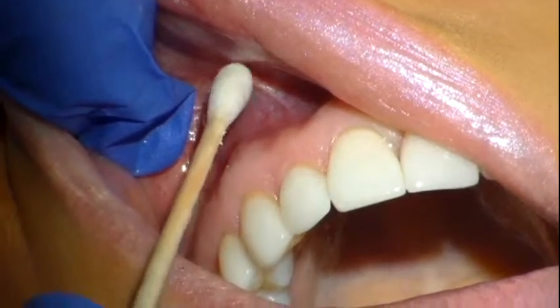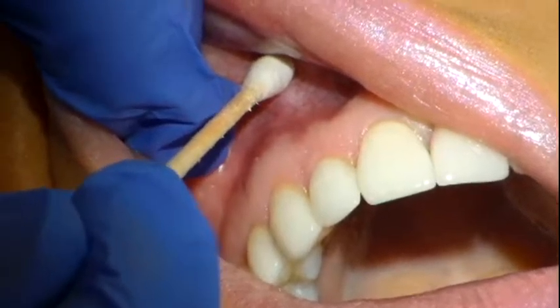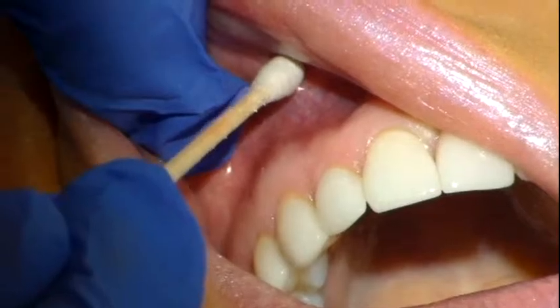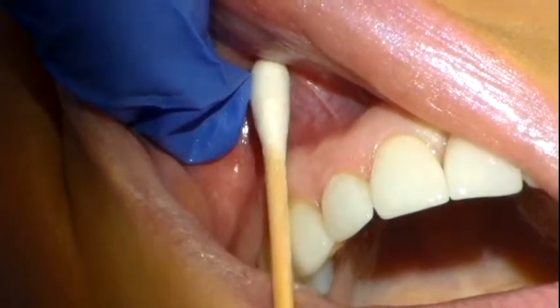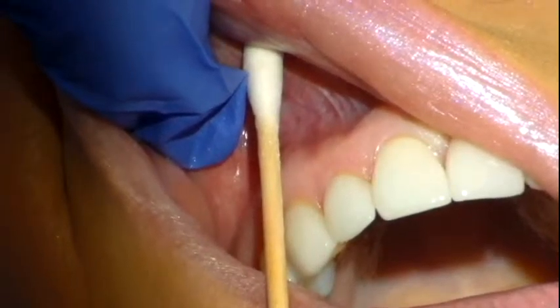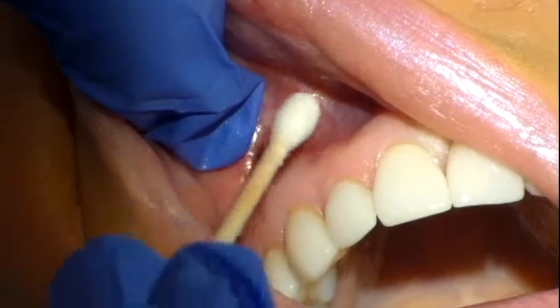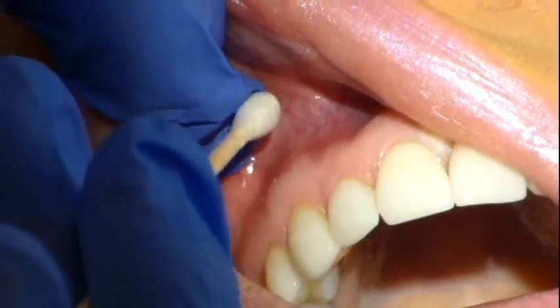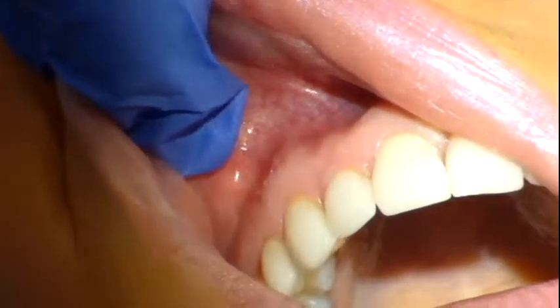And then you're going to go to the height of the mucobuccal fold, and you're going to make sure that you're parallel to the alveolar slope. Some people have a really steep slope to their alveolar process, and you need to match that, because if you don't, you're going to end up coming away from the root and away from the nerve. So you have to make sure that you're sloping with that. And that can be kind of tricky sometimes, because then you're way out in the air and it feels a little shaky. So you're going to see when I do this injection that I give myself a fulcrum to help myself stay steady.